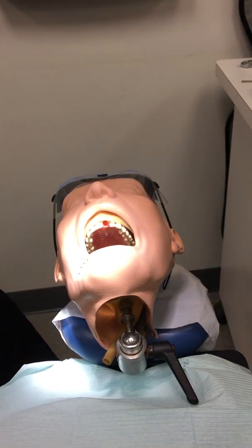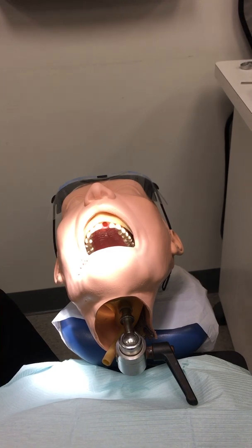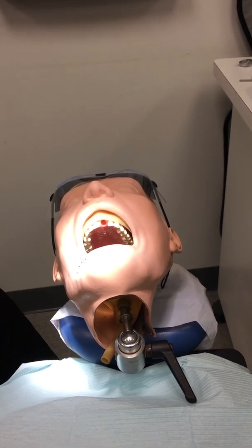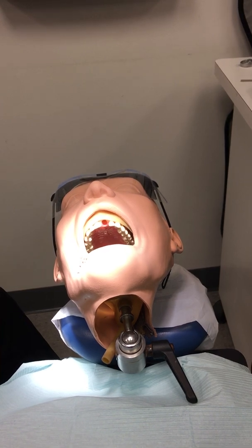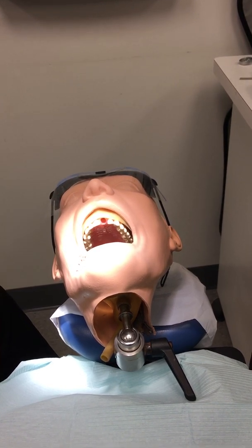Give the patient a mouth rinse and suction with the saliva ejector. The doctor may leave the room to let the patient get numb for five to ten minutes — observe the patient. Then place the dental dam, if necessary, with a mouth prop.